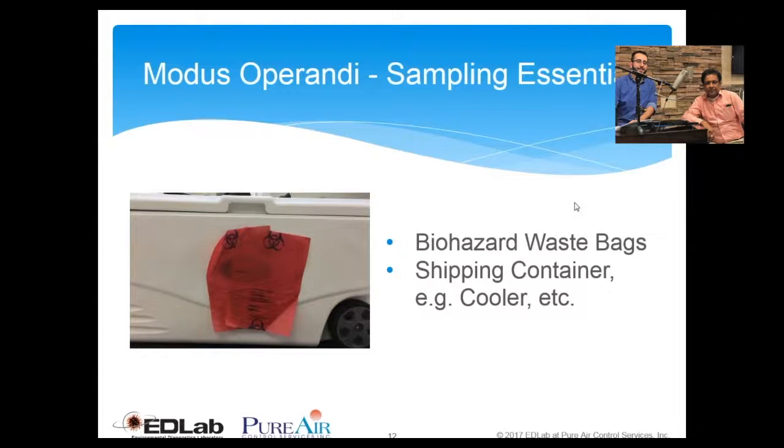As I was describing, there is some office stationery you should definitely be carrying with you. But nevertheless, many of the sample collectors forget that they are going to generate some waste. So make sure that you also carry a biohazard waste bag.